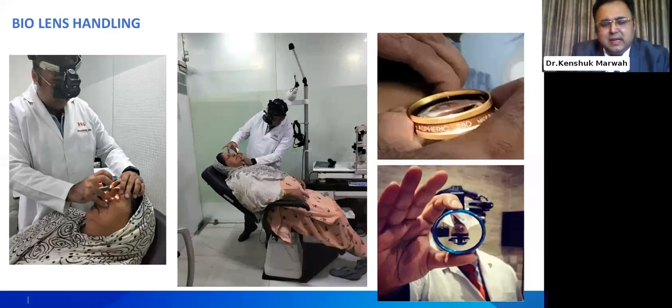I would suggest that residents start from the temporal aspect, and then start to look at the other sides, asking the patient to look in various gazes. All these examinations are mentioned very nicely in our textbooks. The image is inverted and laterally inverted, which we have to keep in mind. My image is upside down, so you have to figure that out in your mind and make it straight.